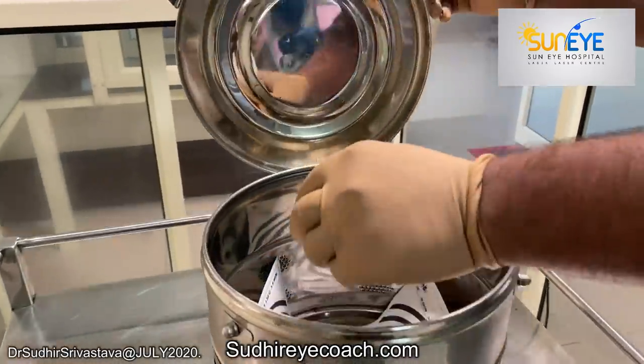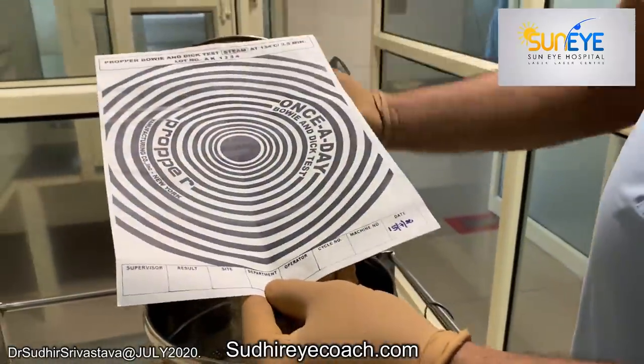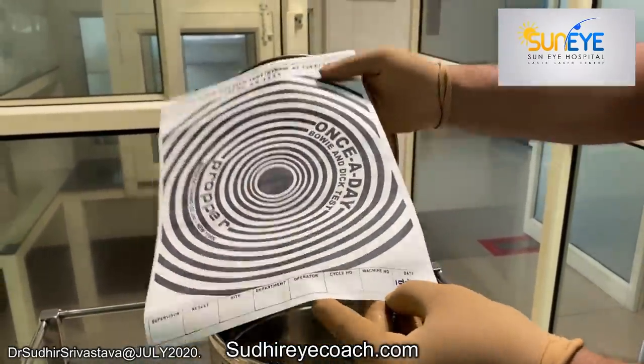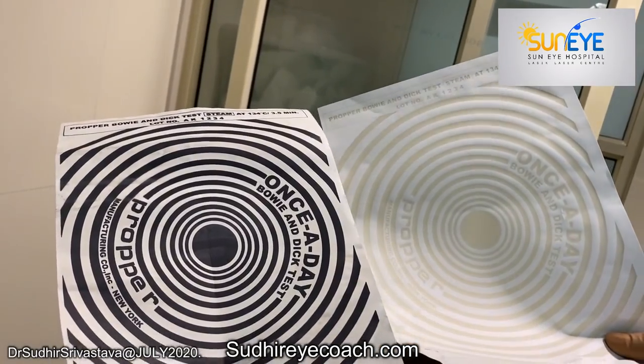Once the cycle is complete, remove the sheet and check for the color change. If the color change is even and dark, it means the sterilizer is working properly. Any uneven color change means the sterilizer needs service.